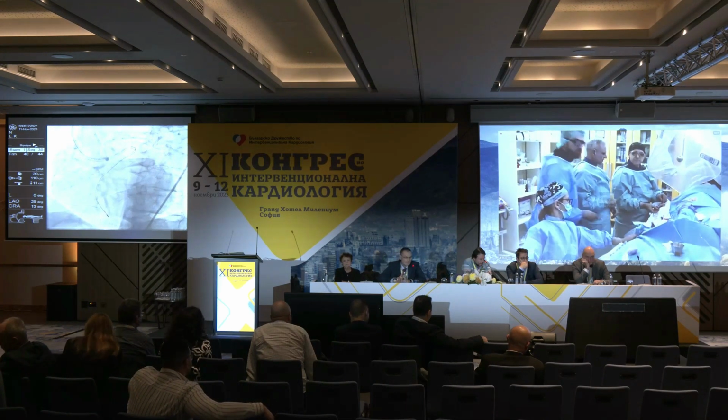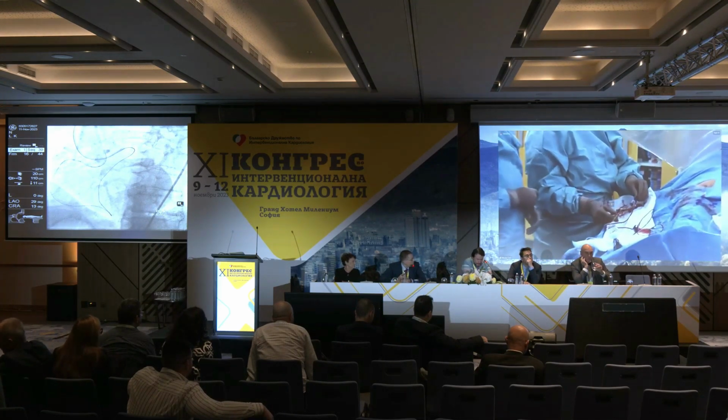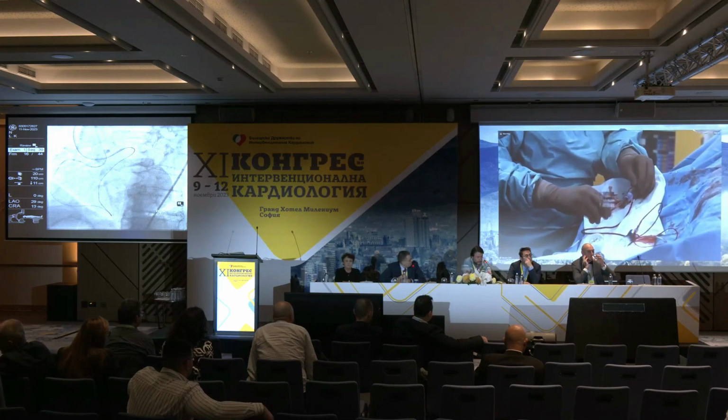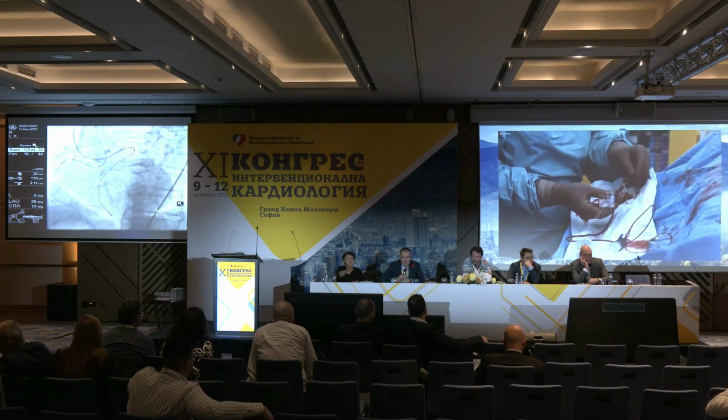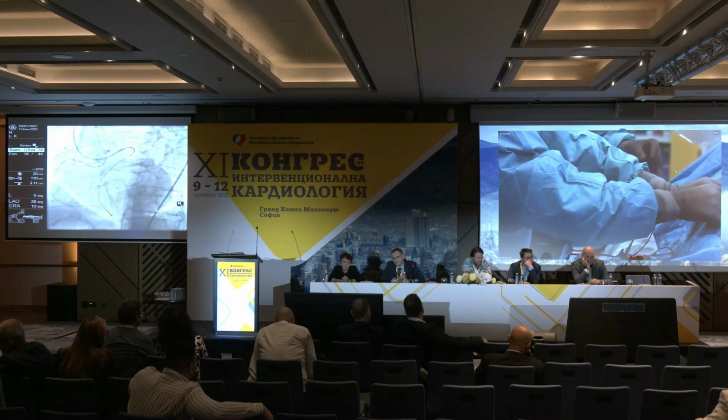Can you see the hands of Dr. Gelef? No, I just asked to have a second camera. Yeah, we have it on the big screen behind us, but we don't have it in front. Okay, we have. Let me wire a little bit more, okay, Dr. Gelef, and then we go back.